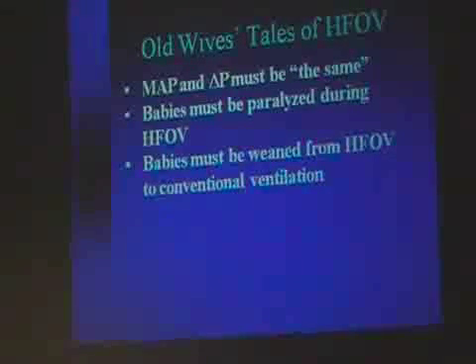That is another old wives' tale that has never ever been demonstrated. It's called choke points. Burt Bonnell used to talk about this, and I used to slap him upside the head because he never had any data. It's a complete misunderstanding of what's actually going on with the oscillator, because of the attenuation that you have, that basically can't happen. You would have to set it in the most bizarre way for that to ever happen.